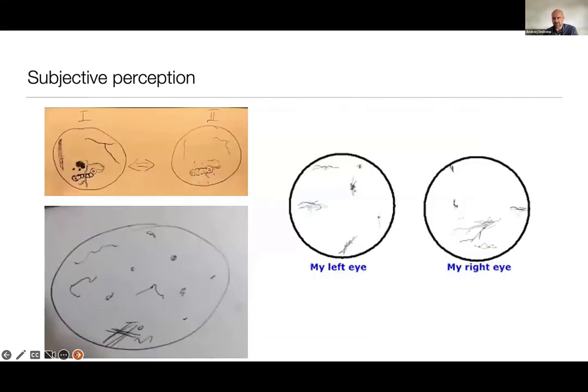When it comes to their perception, many of us are focusing on patients' drawings. So from time to time, I'm still asking patients to do it, because it's not really clear in many of those eyes to say which floaters are really the ones responsible for a specific problem.